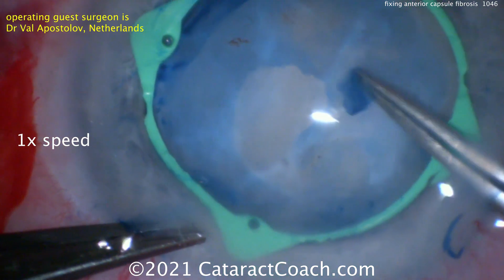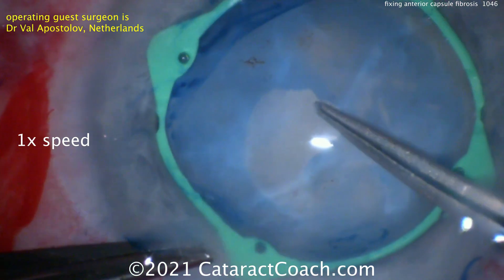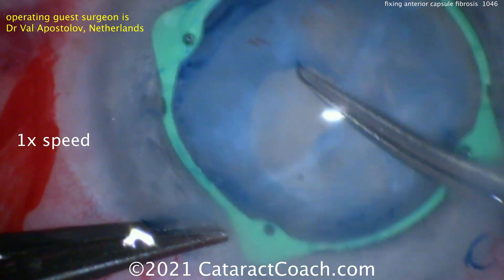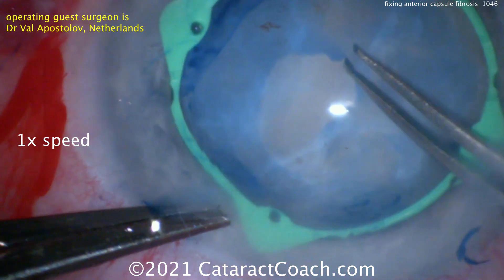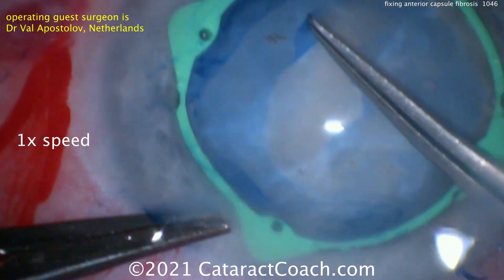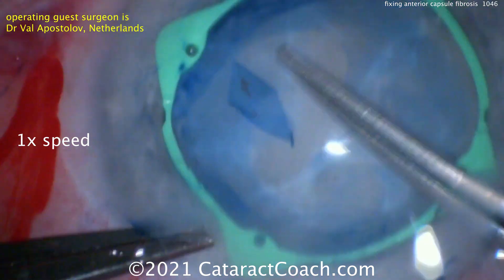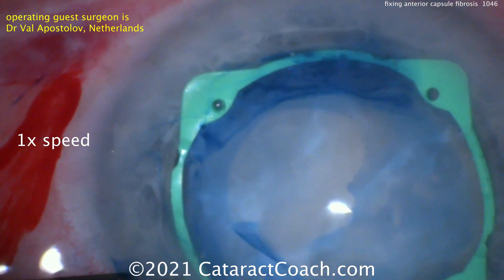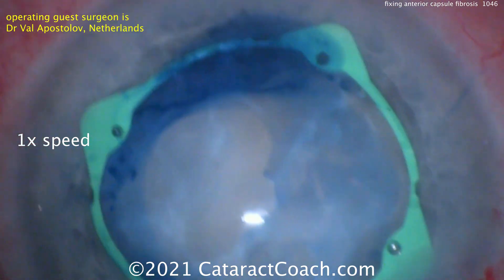He does this very gently and carefully, and you'll see he's able to create a nice rhexis. That's only a partial rhexis, which is perfectly fine. Now again, he wants to separate underneath — you can use the forcep tip like he's doing, or a spatula or some other hook — really separating away the undersurface of the anterior lens capsule from the fibrotic cortical material. Now he can go and create his full-size normal capsule rhexis.